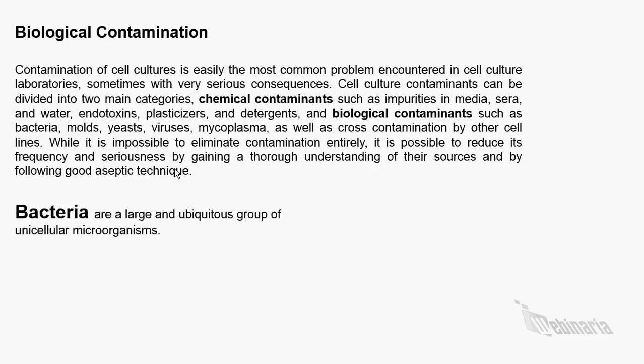While it is impossible to eliminate contamination entirely, it is possible to reduce its frequency and seriousness by gaining a thorough understanding of their sources and by following good aseptic conditions. Successful cell culture depends heavily on keeping the cells free from contamination by microorganisms, like I mentioned previously. There are several aseptic techniques designed to provide a barrier between microorganisms in the environment and the sterile cell culture. Sterilize your work area, maintain very high personal hygiene, and sterilize all the reagents and media.